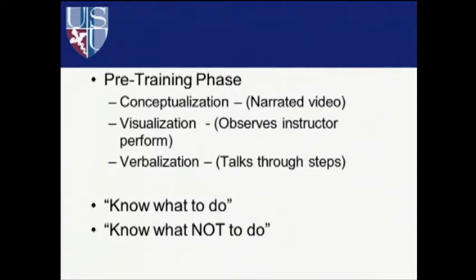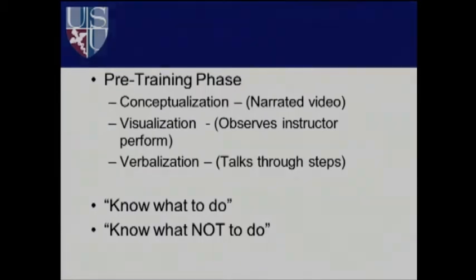They can talk through what they're supposed to do. And probably equally as important as knowing what to do is knowing what not to do, or what is unacceptable. And one of the examples of that in FLS is not being allowed to balance the little triangle on one of the posts in peg transfer. I mean, there's a bunch of little intricacies to each task that it's important that you don't turn them loose to practice without them clearly knowing not to practice a skill like that.